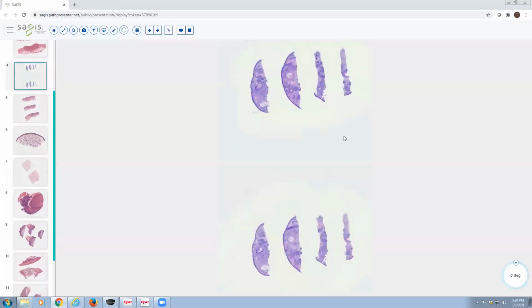Now we're going to go on to another tricho, which is similar, but has some important differences. And this is trichoepithelioma. So one of the big differences that you'll notice on scanning is a difference in size. Trichoblastoma is large, trichoepithelioma is small.